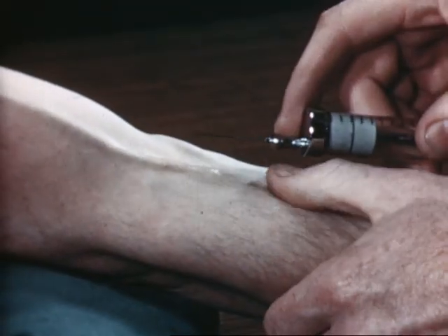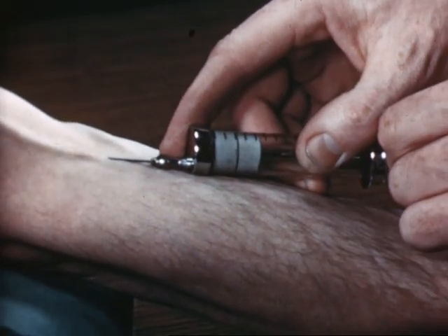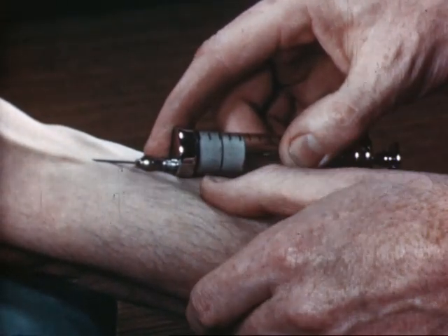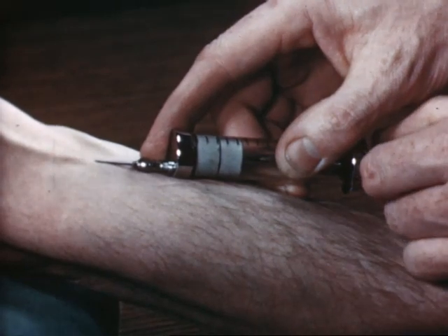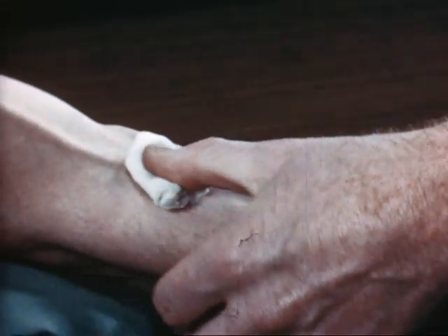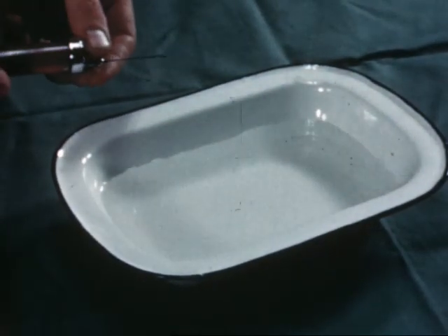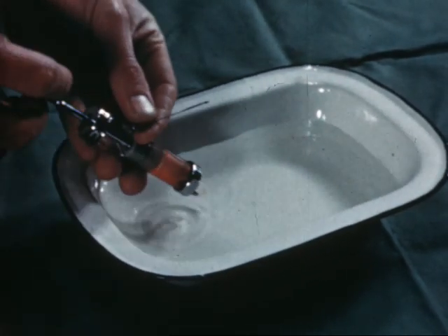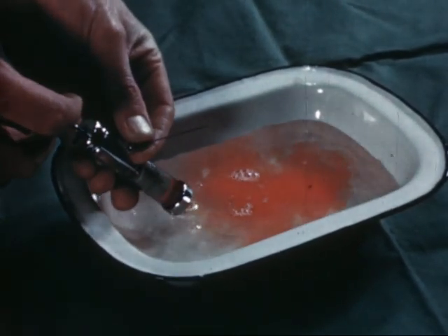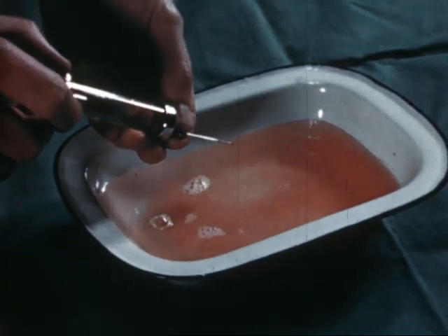Another fault is a blocked needle. You may feel sure you're in the vein but be embarrassed to find that the needle is blocked owing to the fact that it wasn't washed out after its last use. The unfortunate patient has to be punctured again. The syringe and needle should be washed out in cold water, or in weak Lysol solution if the blood is likely to be infected, immediately after use.